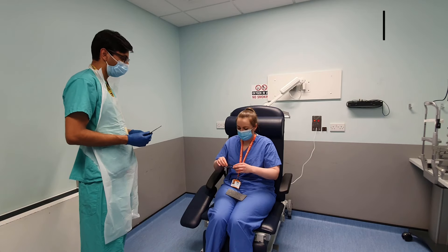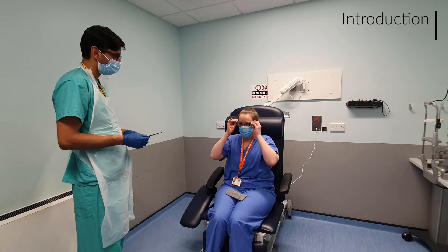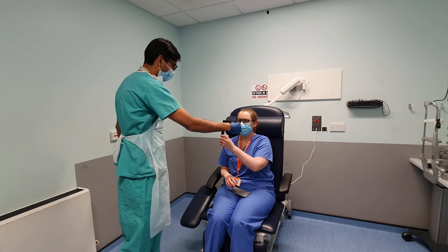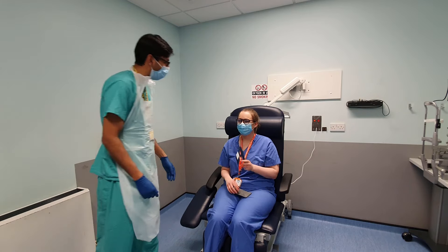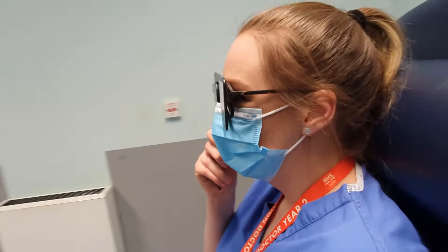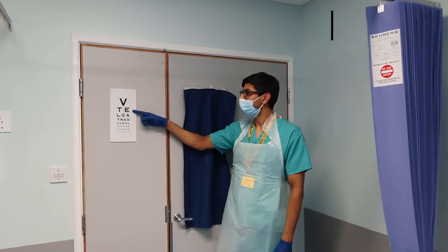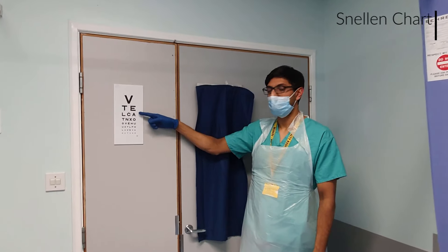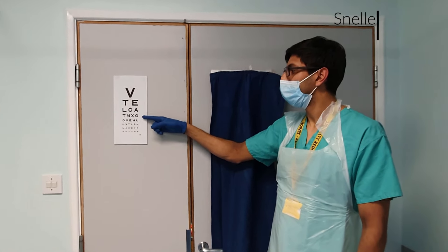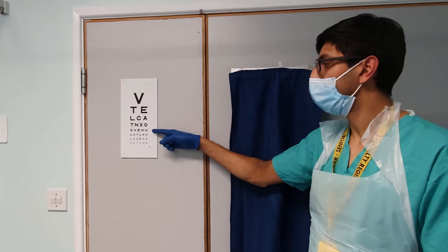Visual acuity, or VA, is an essential part of assessing a patient with an eye complaint. It measures the ability of the eye to distinguish details or clearness of an object at a given distance. In this video we'll be using the Snellen chart, as this is the simplest and most commonly used in places such as an emergency department and general practice.